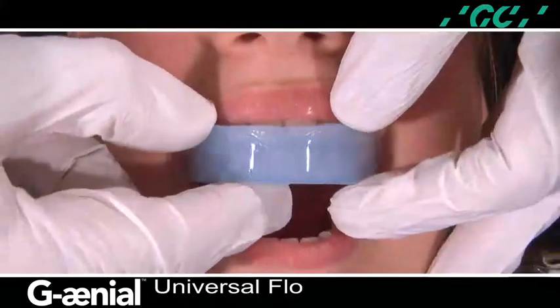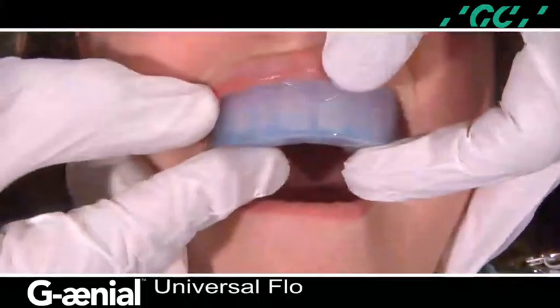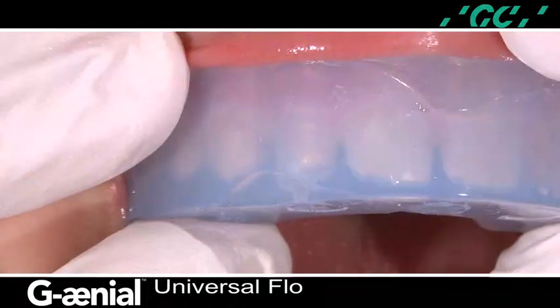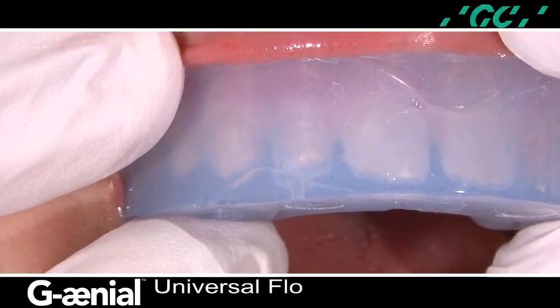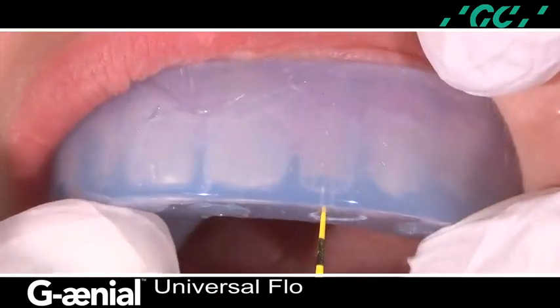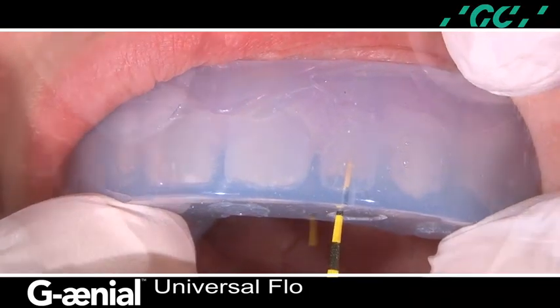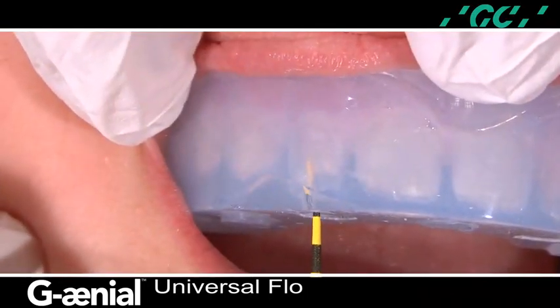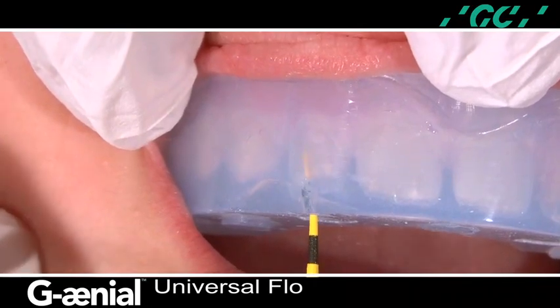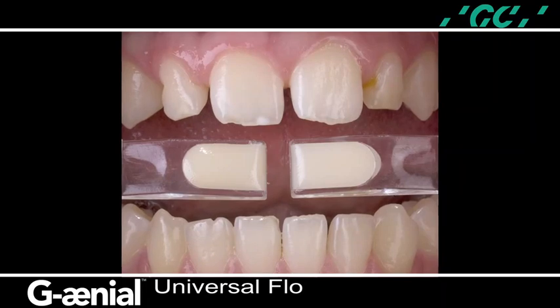Before beginning the restorative procedure, the silicone tray is tried in and inspected for proper adaptation and a complete seat. It is important to rehearse the path of insertion of the syringe tip, and this can be accomplished using a periodontal probe. Notice the opening is placed at the incisal facial edge in the middle of each lateral incisor.